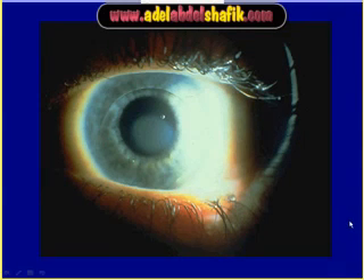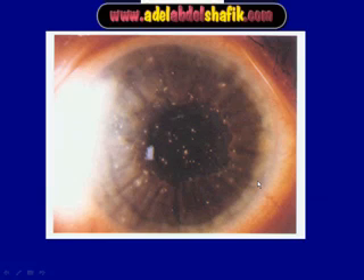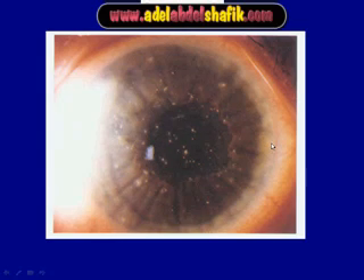With light on one side of the limbus and the opposite side illuminated, a ring is visible here — this is an immune ring from an ancient antibody reaction in the cornea. Additionally, multiple foreign bodies in the cornea are visible, not directly, but by placing the light at the limbus on one side until the opposite limbus is illuminated.